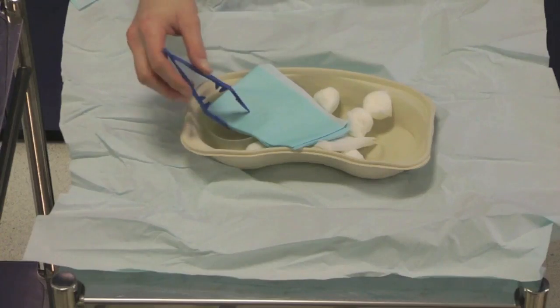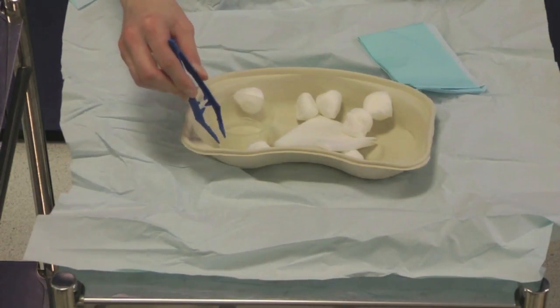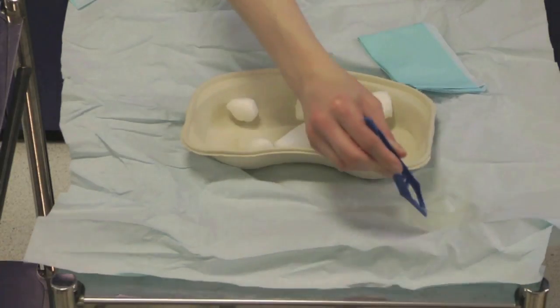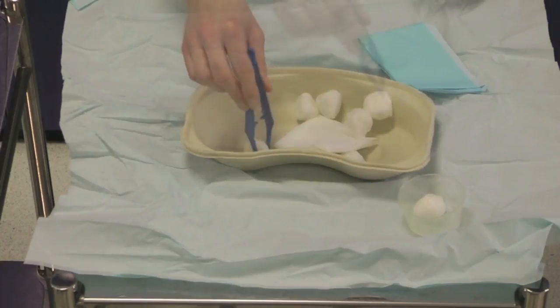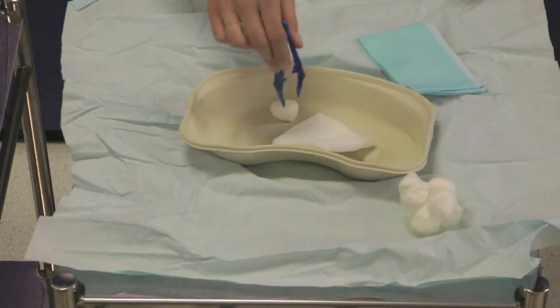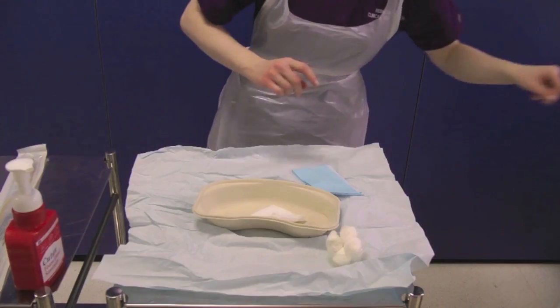Take your sterile forceps and organise the contents of the catheter pack, placing the cotton wool balls into the sterile pot. Discard the forceps into the sharps bin and decontaminate your hands.